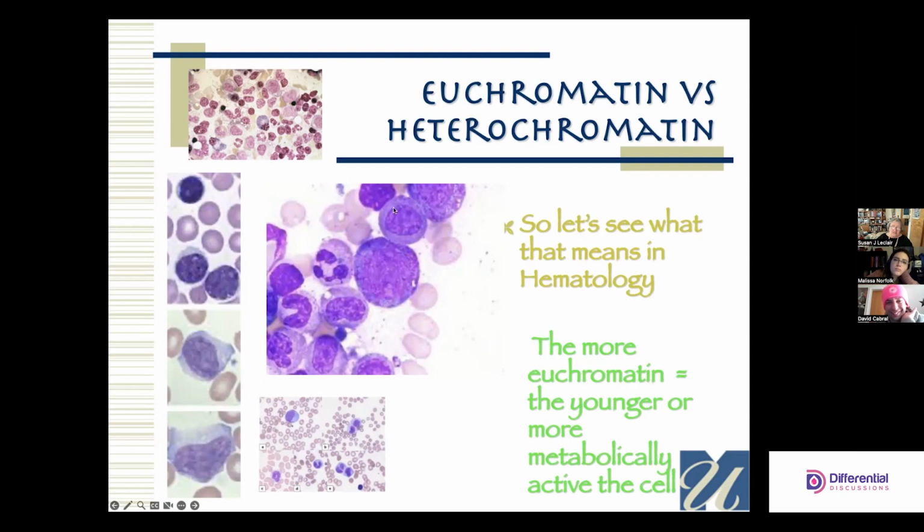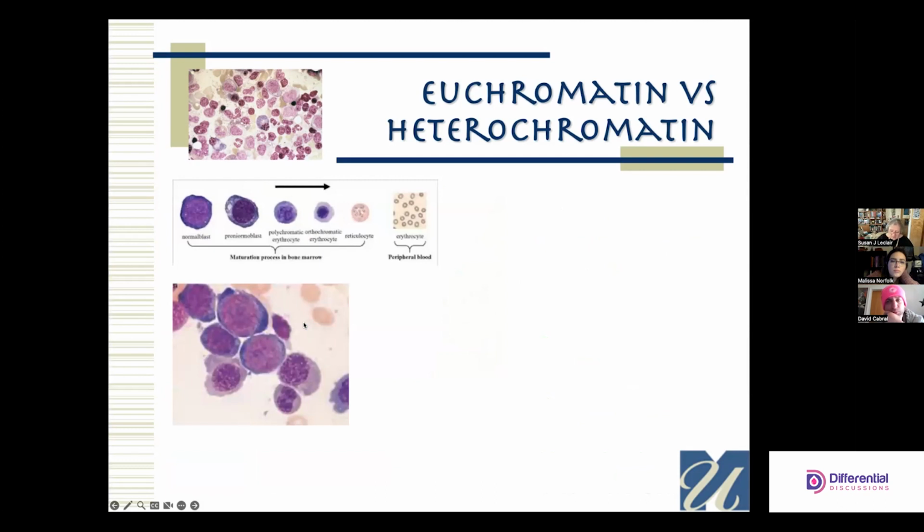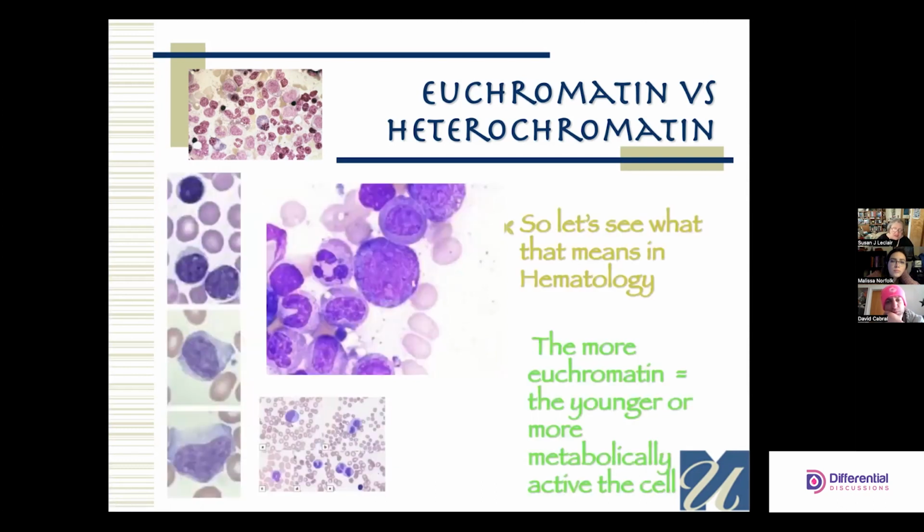It's working on it. Then go to a metamyelocyte. Look at the chromatin pattern. You've got a little bit of stuff up here against the edge, but not a whole lot. A little tiny bit more. And the heterochromatin, the dense stuff, is a little bit darker still, with more of a noticeable membrane. You're not going to punch that membrane around despite what it looks like. And then you get to poly.